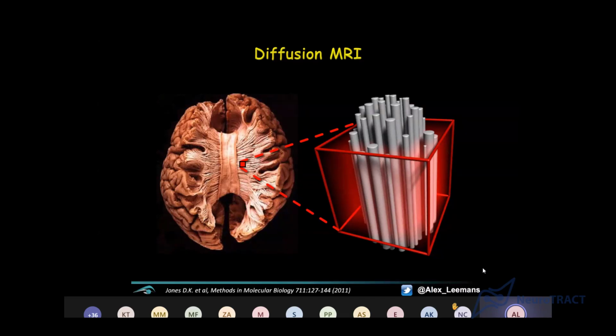Anyway, the point I want to make is that in our brain or any tissue in our body, there are a lot of water molecules, and they are also moving around, bombarding in tissue, because again, we're looking at erratic motion of molecules. And obviously, some molecules are not water molecules, but they do have spinning protons. And it's all about spinning protons, right?